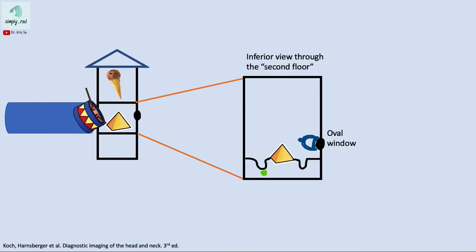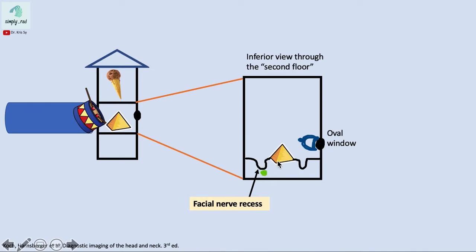Looking at an actual axial image, we identify the depressions on both sides of the pyramidal eminence. The depression lateral to the eminence is called the facial nerve recess. The depression on the other side, the medial portion, is the sinus tympani. We know this is the medial portion because we see the stapes and oval window nearby.